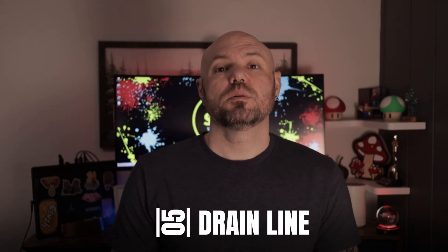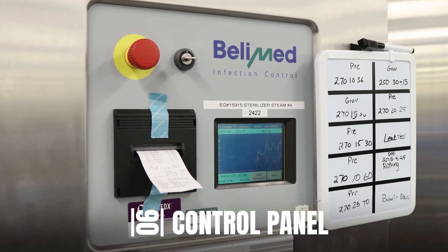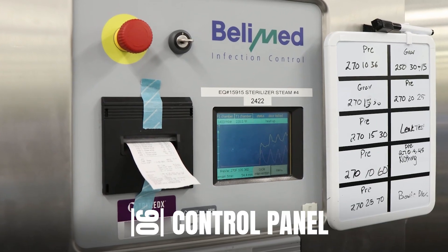The drain line removes air and condensation from the chamber. And lastly, the control panel allows operators to select sterilization cycles and access any other data or functions as needed. Understanding these components helps SPD techs operate, troubleshoot, and maintain sterilizers effectively.